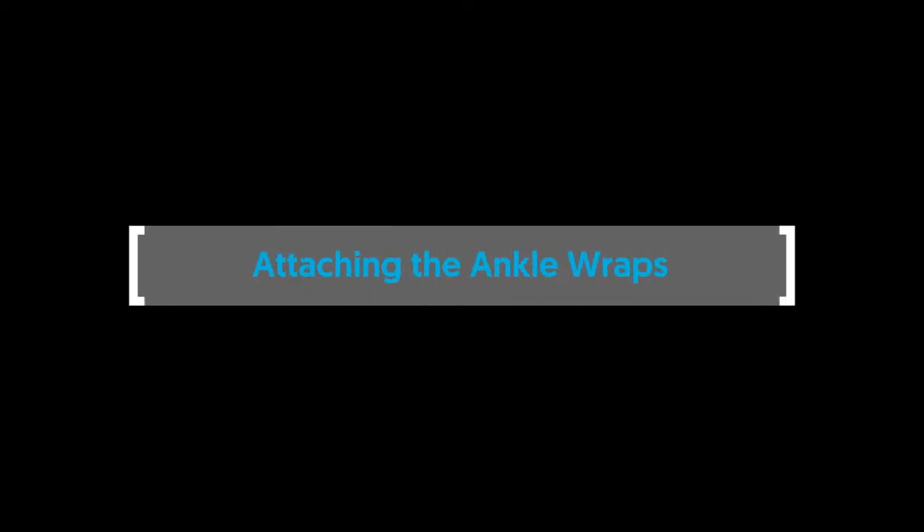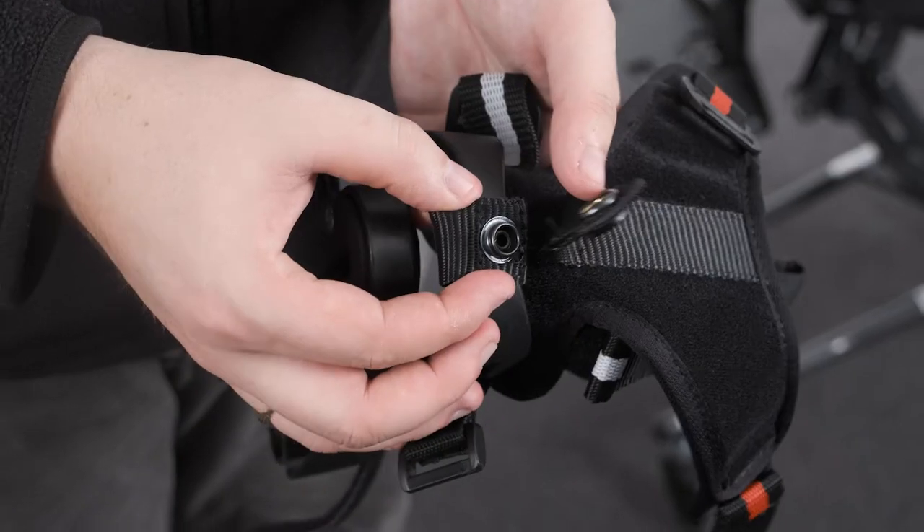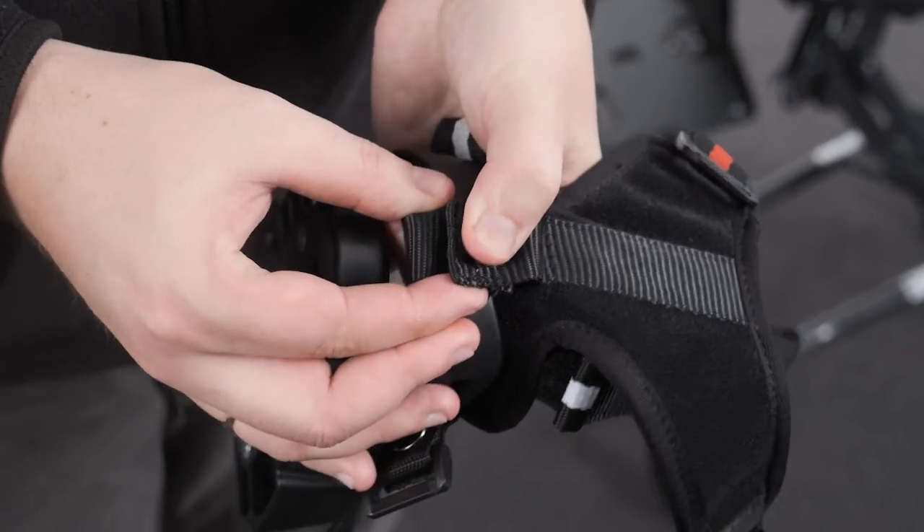Attaching the ankle wraps. To attach the ankle wrap, feed the lower and upper poppers of the ankle wrap under and over the back arch of the sandal and snap together.